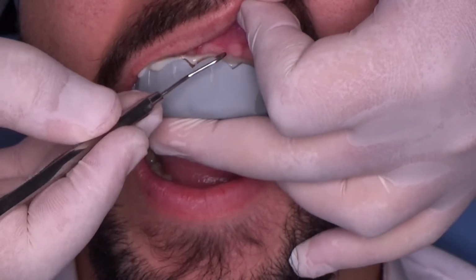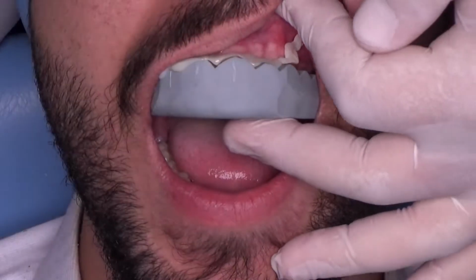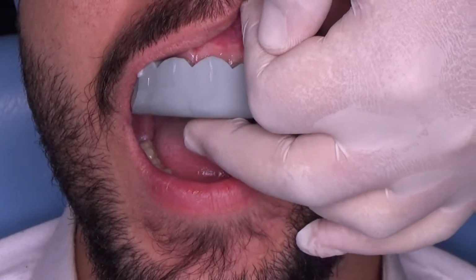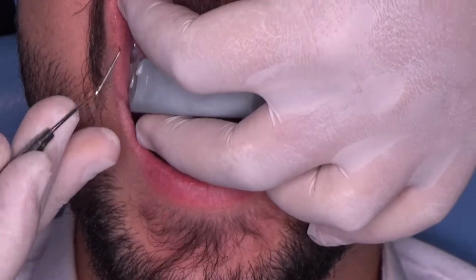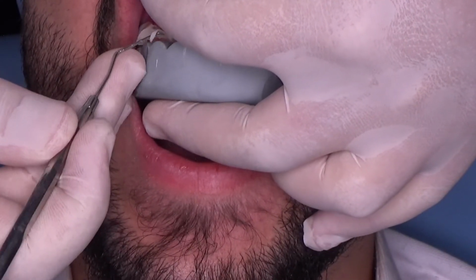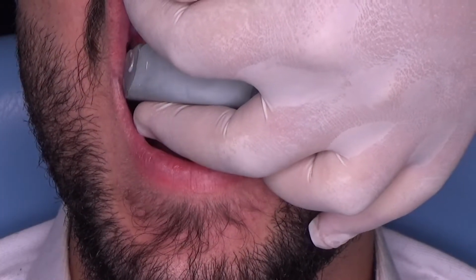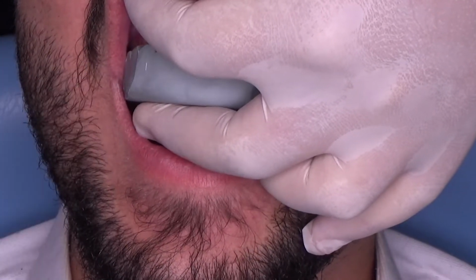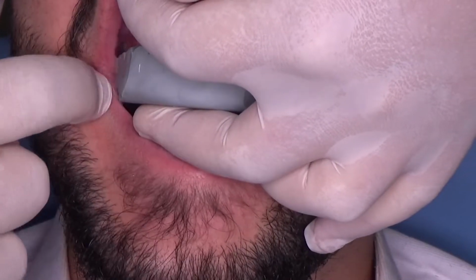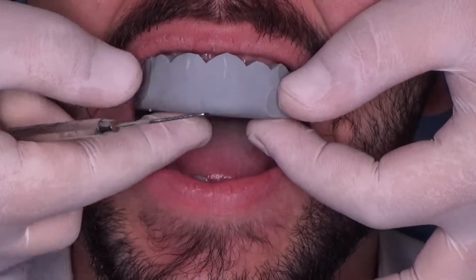See, it's time to start. It falls off very, very easily. So normally you will not have excess of the material. No, when we remove the mock-up, we should not do any corrections with machines in the patient's mouth. And you will wait for 2 minutes, which is the setting time of the bisacryl, no? A minute and a half to remove the excess and 4 minutes for the final set. Yes, otherwise you can remove the mock-up together with your silicone.